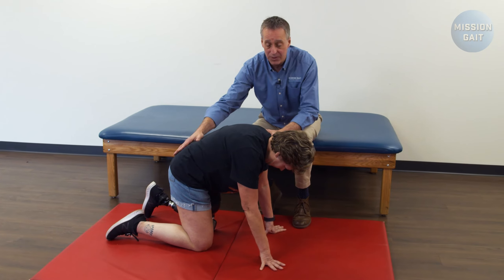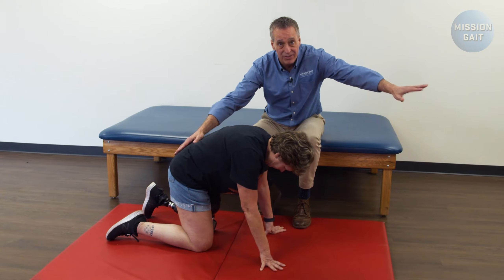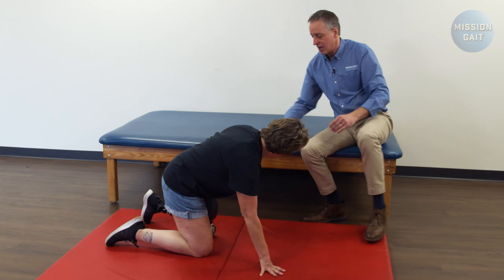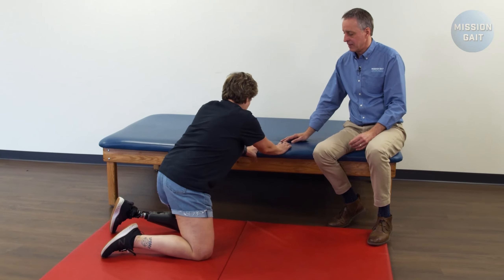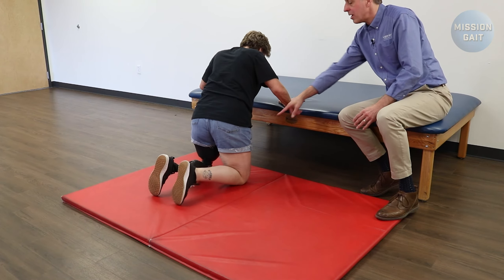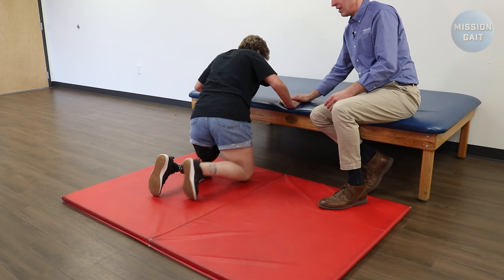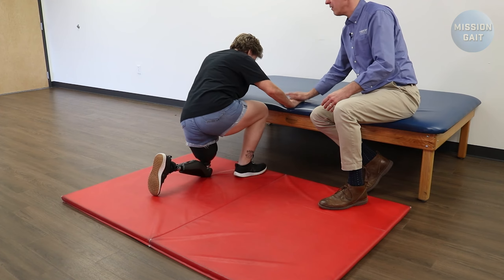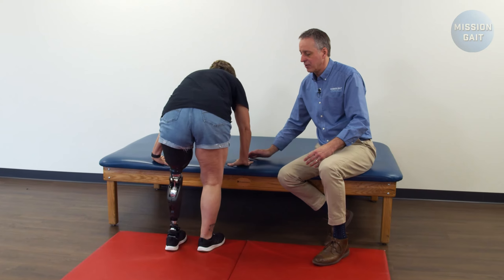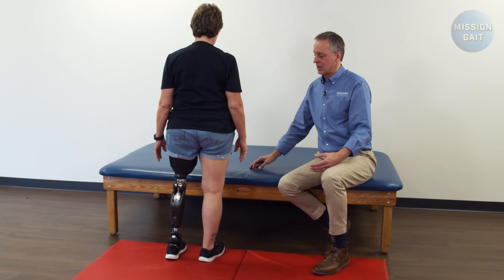From this position, she's in a position where she could crawl to something higher, which is always the thing to do. In this case we have a mat here, so she's going to crawl over towards this mat, get herself in a position where she's kneeling on both knees, then bring her right leg forward into a foot position, lean forward onto the mat, and press forward as she presses that knee fully straight underneath her.